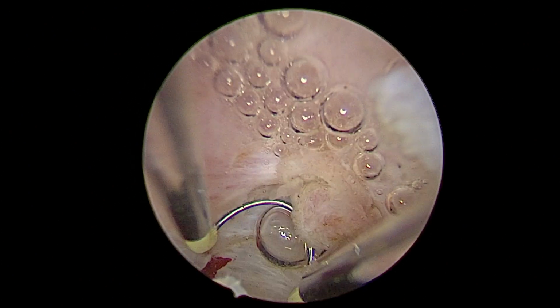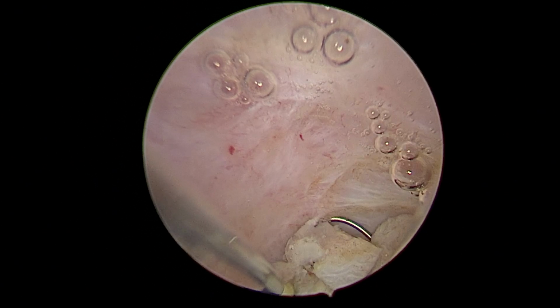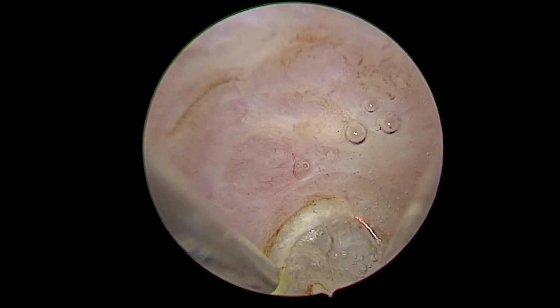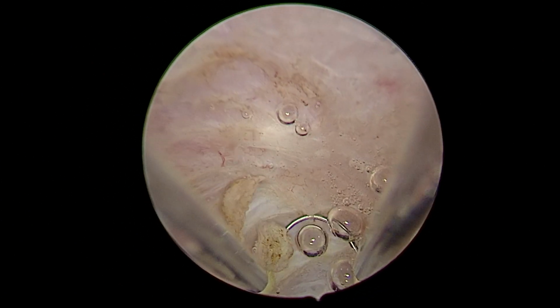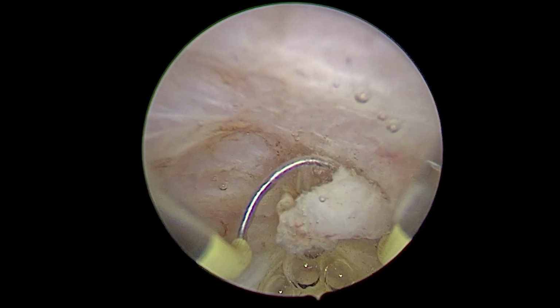Meanwhile, the main aim was either to ablate the tissue in the isthmocele or to resect the tissue. So here you can see very small pieces of tissue being resected with a very nice slow movement of the resectoscope.